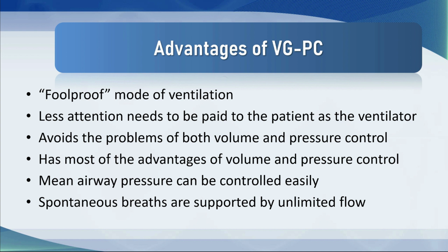It appears that volume guaranteed pressure control has loads of advantages. It's a foolproof mode of ventilation. It can be used by novices at the bedside who are not used to making a lot of changes to the ventilator and indeed may make the wrong changes if they're not careful.